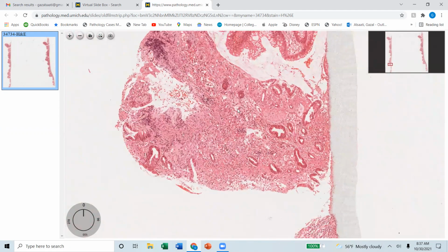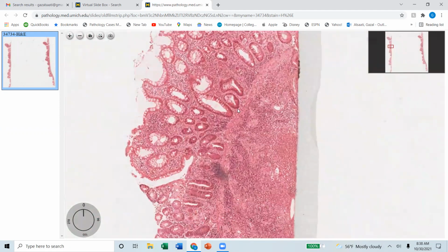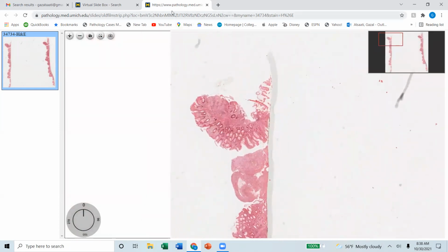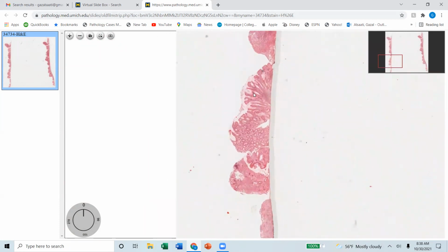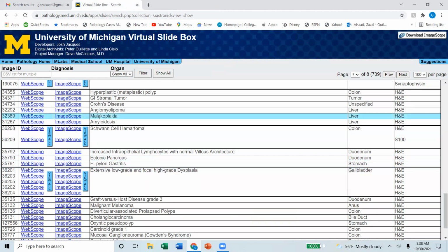You need to look for dysplasia in an epithelium that is intact, like here, okay? And don't worry about the deep crypts here. These are all just normal. Okay, so this is your nice Crohn's. Also in Crohn's, you have to see that you get those skip lesions, some areas that are normal, some areas that are chronically inflamed. Okay.